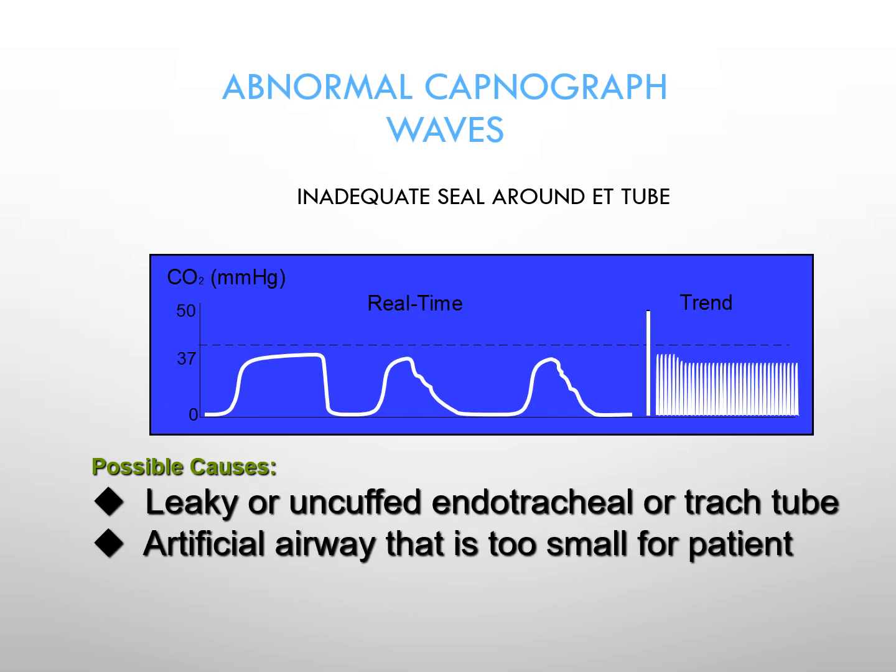In this particular capnogram, it is indeed abnormal, and just look at that, when we compare it to the normal, it fails to basically maintain a plateau. When you think about what's actually happening, it's failing to do that because there's some sort of a leak, some sort of introduction of, I'm going to say, room air. And for all intents and purposes, room air has essentially very, very little CO2. So for practical purposes, from the standpoint of the equipment used in capnography, it's essentially imperceptible.